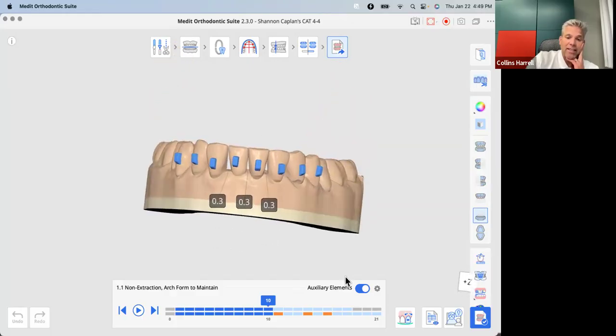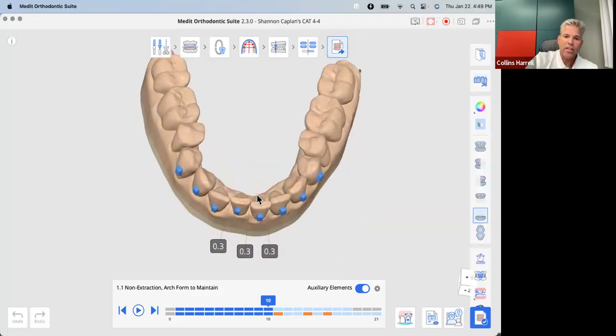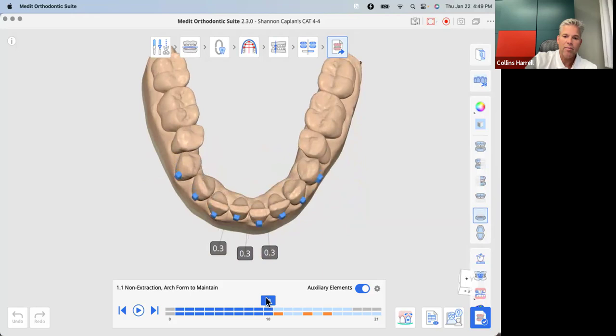And now it's no longer guessing. And so as it starts to finish up the case, it actually knows exactly what every interproximal surface looks like. You've gotten a lot more of the tooth anatomy exposed to your scanner to be able to pick up just by taking that first swing off the fairway. So we're not swinging for a hole in one.